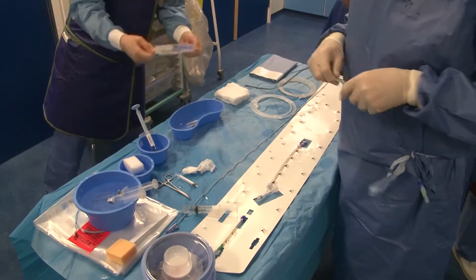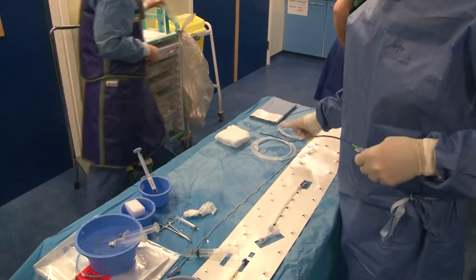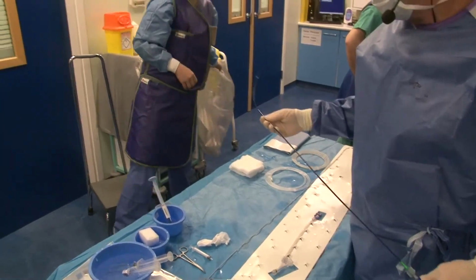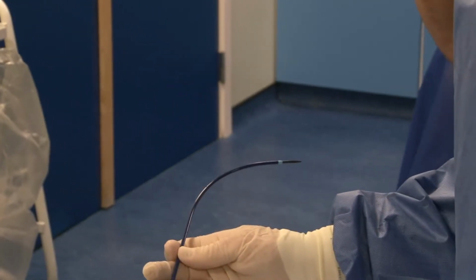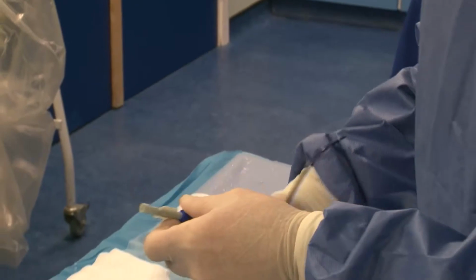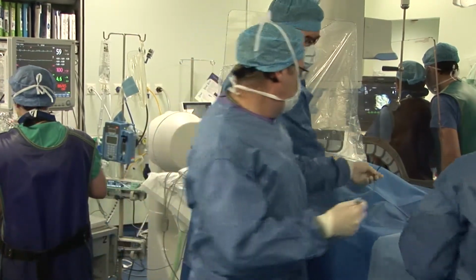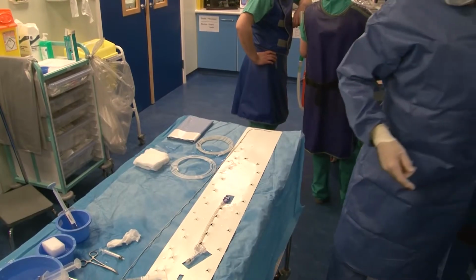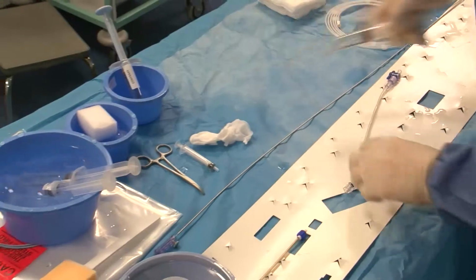It looks a bit more than that, but once we've got the dilator in, it's about a 45-degree bend at the tip. And we'll use this to deliver the PFO occluder device. We're going to take a 25 millimeter Platzer occluder device. And I'll show you how to get the occluder device ready in a second.